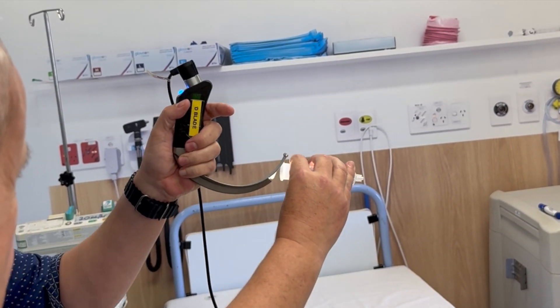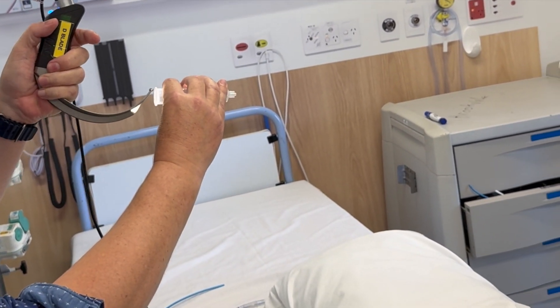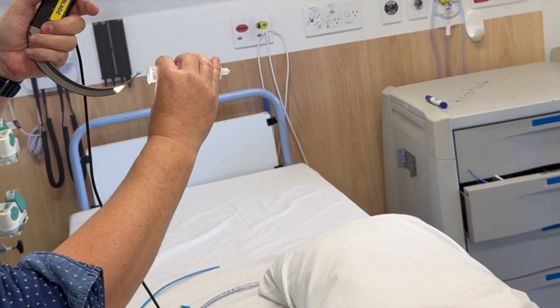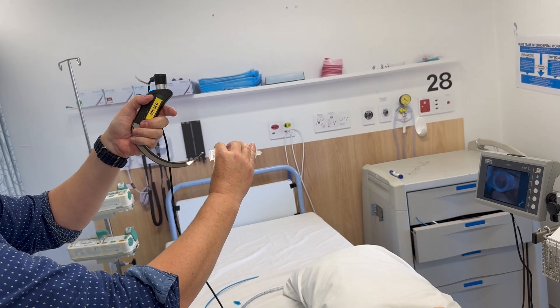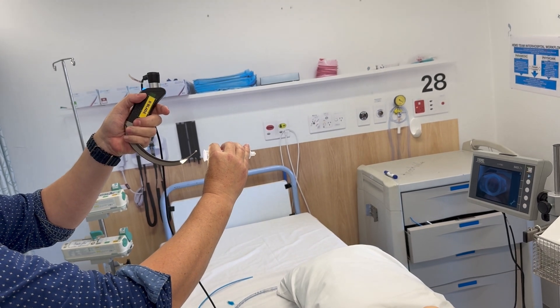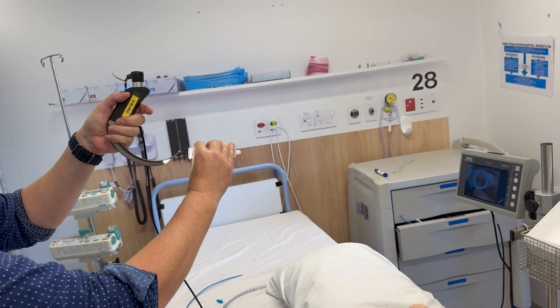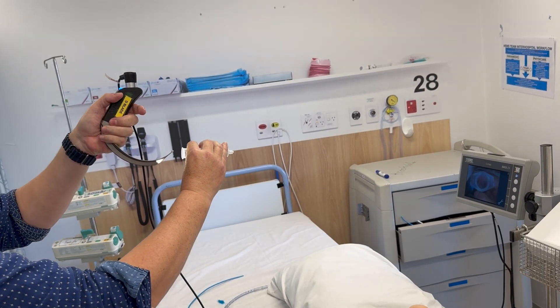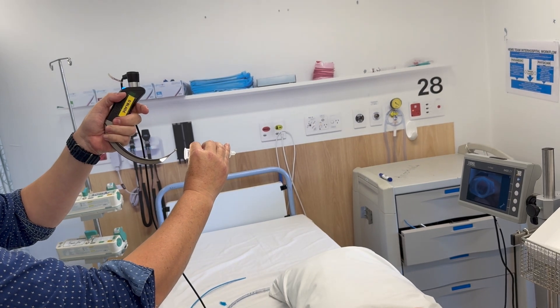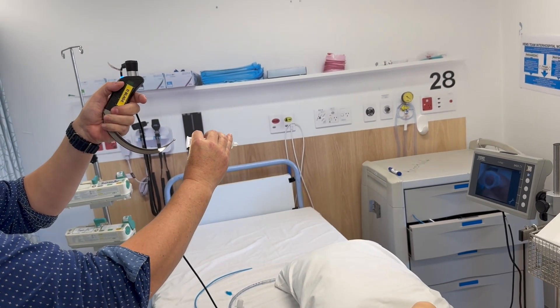So if you have that sort of view, to correct it, what you want to do is withdraw the blade, rotate the blade, and lift the blade. What you have now is a nice wide-angle view. Your glottis is often in the top half of the screen, and you're looking much more down the long axis of the trachea. So that's the view you want.